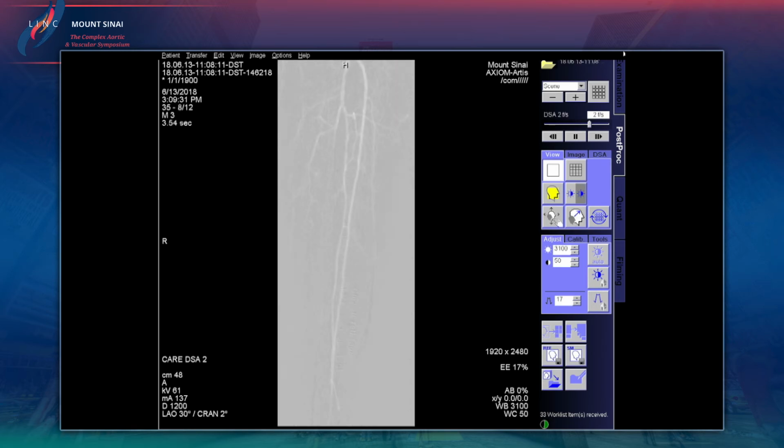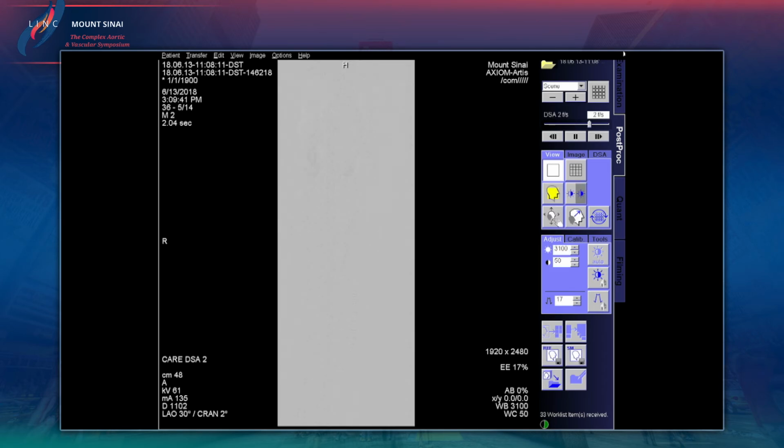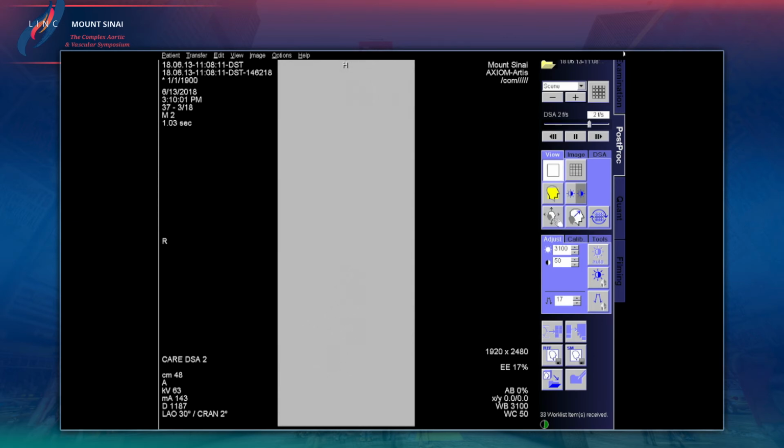You can see here, this is just a negative angiogram, forgive me. You can see here that the flow, once we were able to get rid of everything in that anterior tibial artery, looks pretty good. There seems to be a little bit of recoil right at around maybe the next one, maybe it's an overlap here. It's like venous flow, maybe another projection. Let's see what we're going to do.